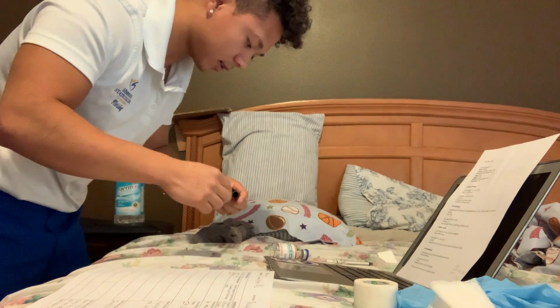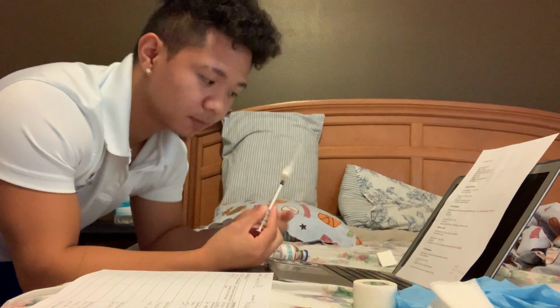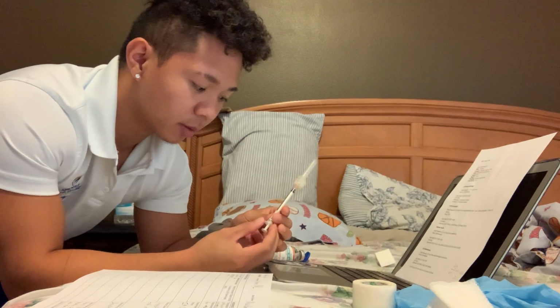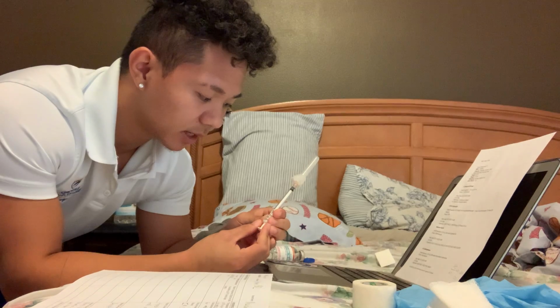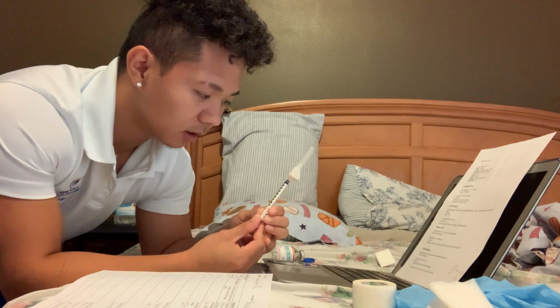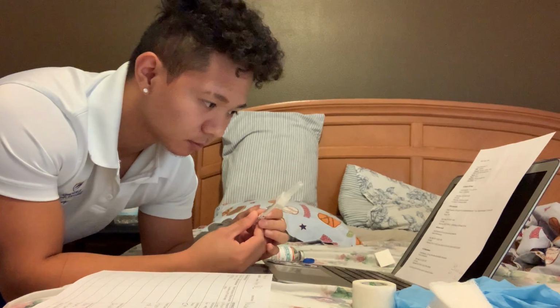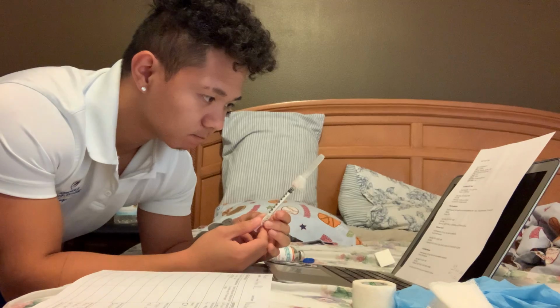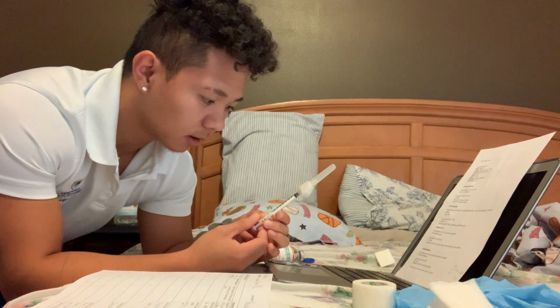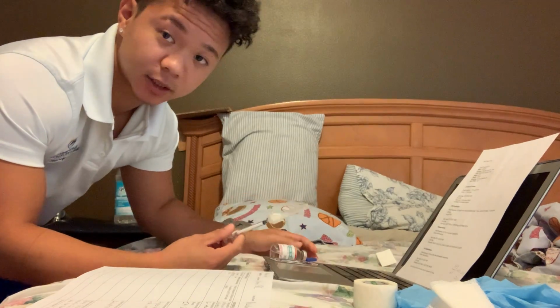And once that's done, I'm going to select the correct syringe. So here I have a 1 milliliter 25 gauge 5/8 syringe, and after I've selected the correct syringe, I'm going to do my second check.